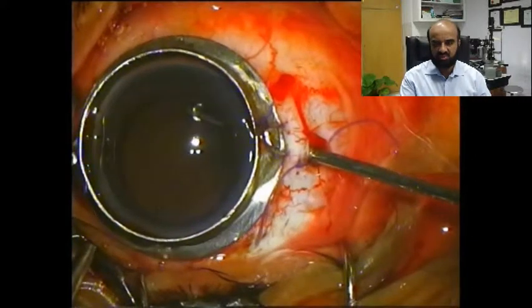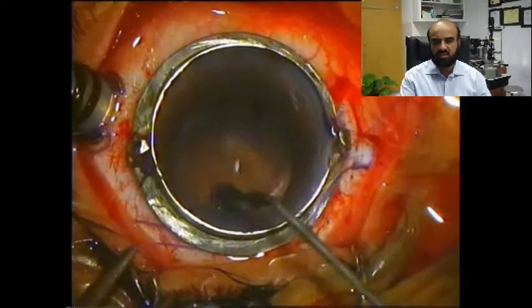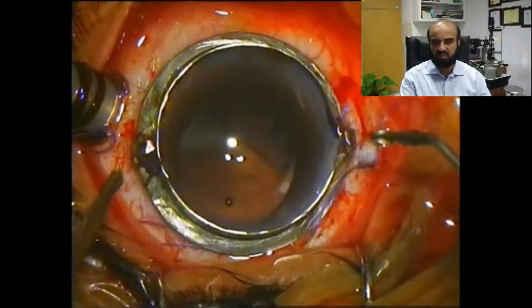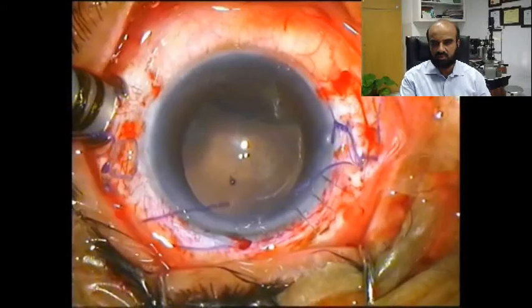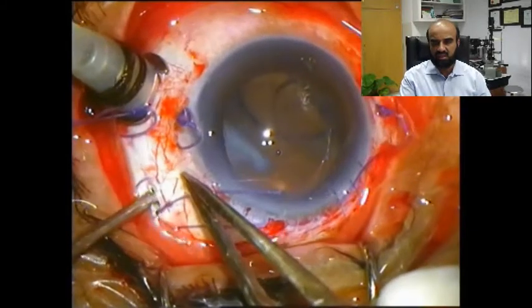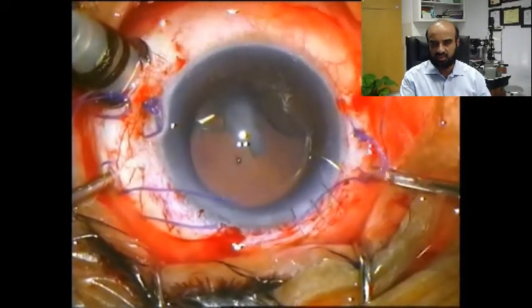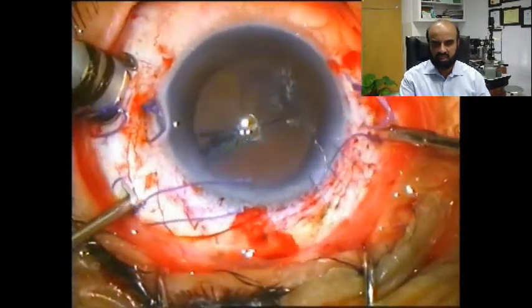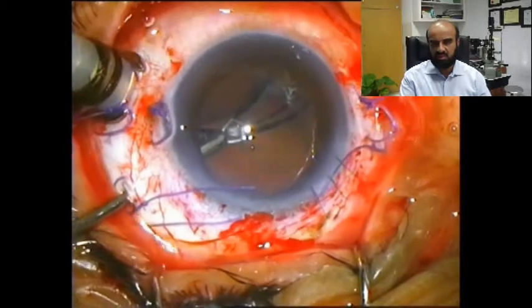Through the rent, anterior vitrectomy is underway. While performing the vitrectomy, we realized that the pseudophakos was already floating in the mid-vitreous cavity, and the margin of the lens became visible in the visual axis. So we altered our plane and decided to remove this wandering pseudophakos first. We removed the ring, and here you can appreciate more clearly the intactness of the capsule superotemporally and the wandering PCIOL lying infranasally.